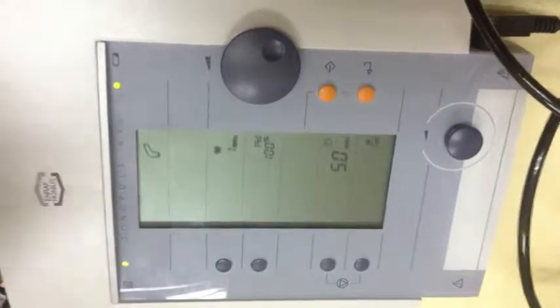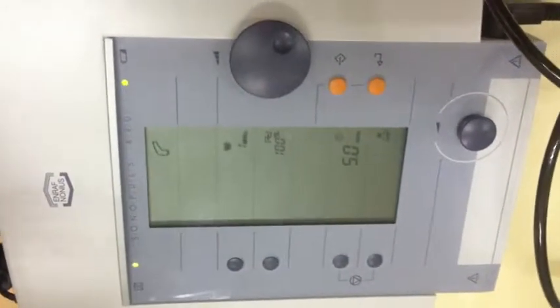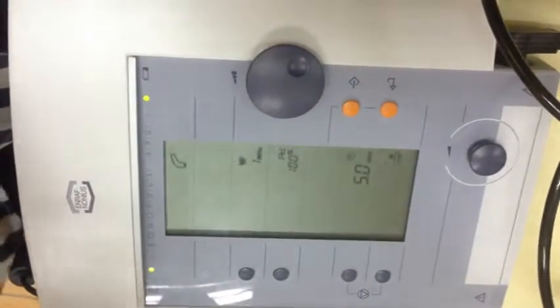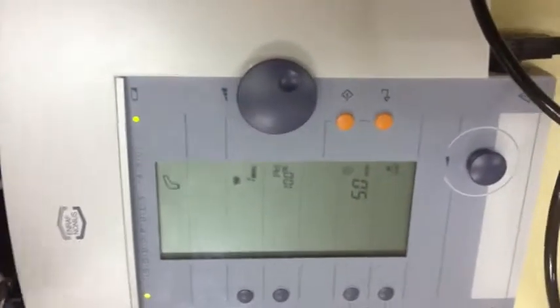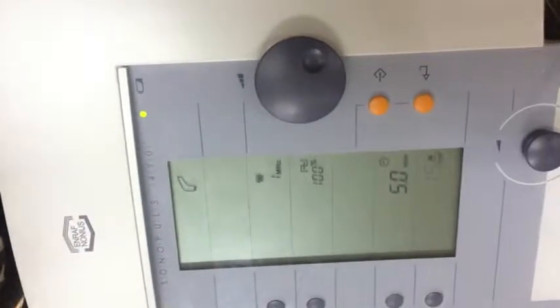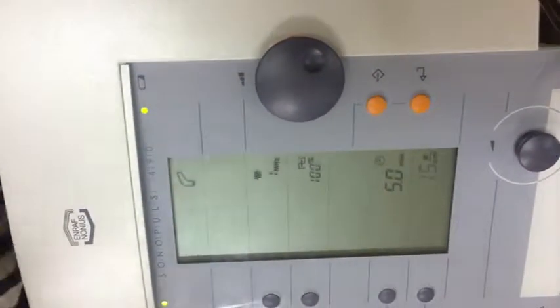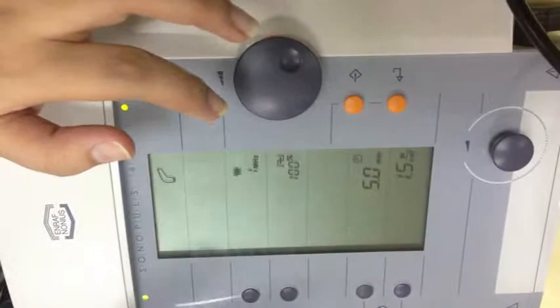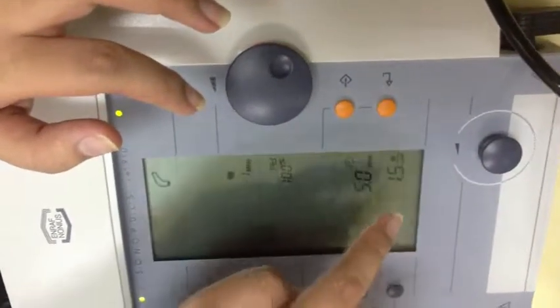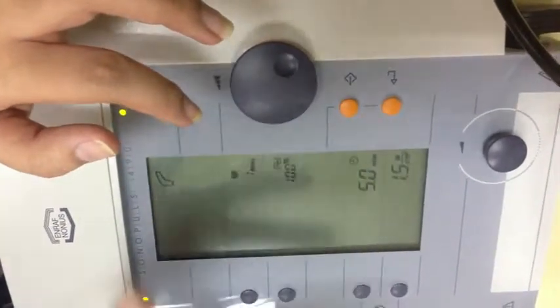So, again, pag acute, gusto natin mas mababa yung intensity. Pero usually naman, let's say, for example, low back pain due to improper posture, so most likely chronic yan. So, mas ginagamit natin yung mas mataas na intensity, which is at most 1.5 watts per cm squared. Pero, makikita nyo sa references, they would suggest hanggang 2 watts per centimeter squared, acceptable. Okay, but for clinical practice, we use 1.5. Yun yung pinaka-average na. Okay? So, kung nakaset na siya sa 1.5, usually naka-default siya at 1.5, so kung hindi mo na siya babaguhin, leave that at 1.5.